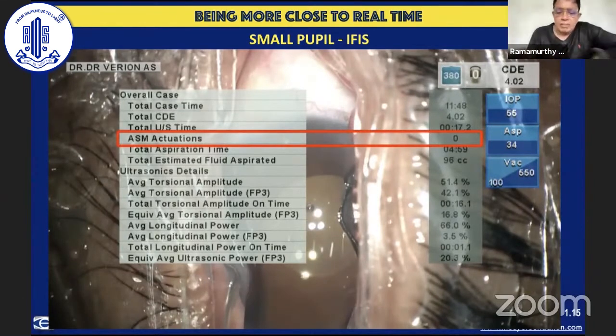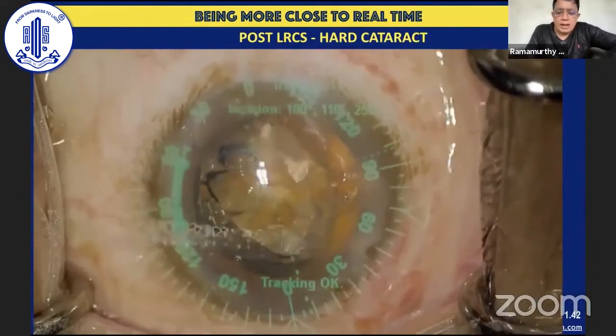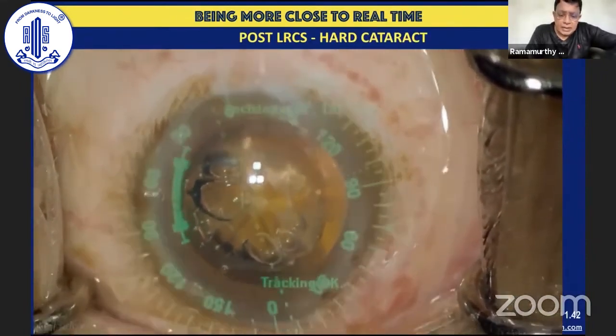So it's an on-demand safety feature that you have. And in this particular case, I could do it even without it being actuated once. Passing on to a slightly harder cataract over here, which has been treated with the laser.